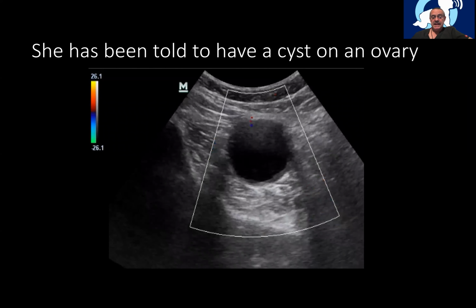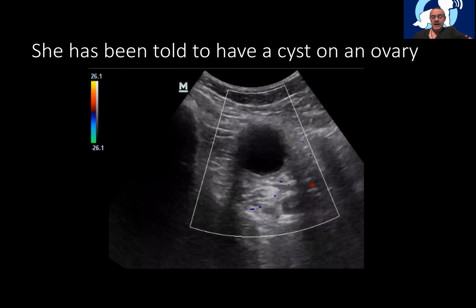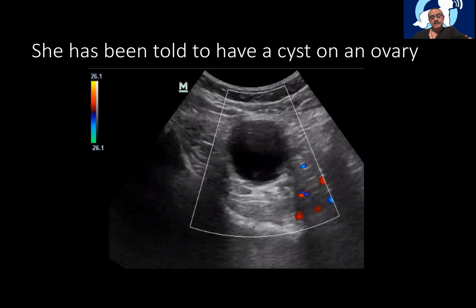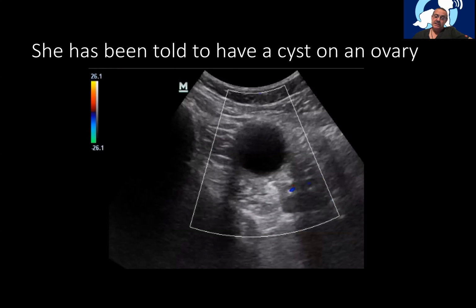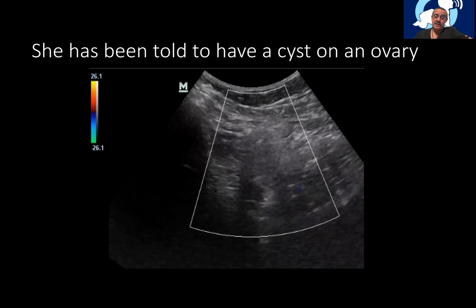This is a scan on the upper right side of the pelvis, almost upper abdomen. And I didn't see ovary or uterus. Not related with that. So let's search for the ovary.